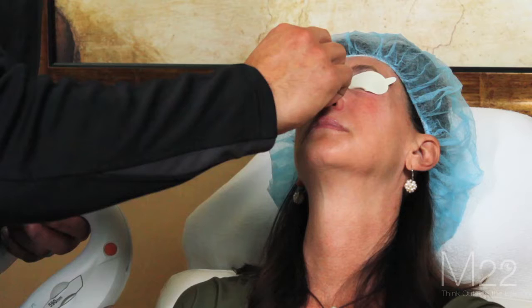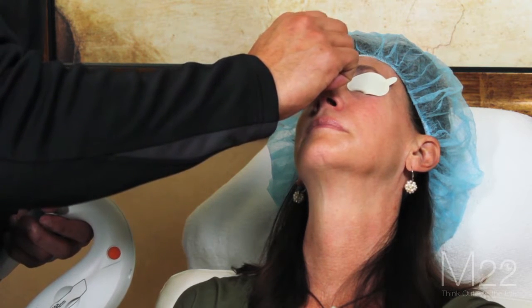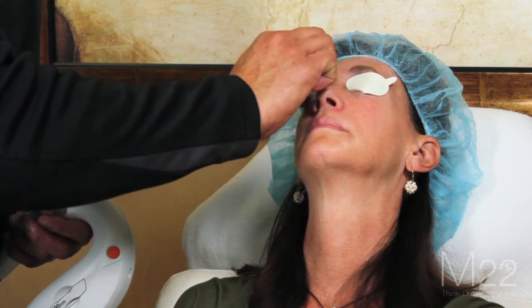If the light goes deeper into the retina, it can affect the retina. So you really want to cover those eyes. What I tell the patient to do is open their eyes, look up, close, and we put the filter.